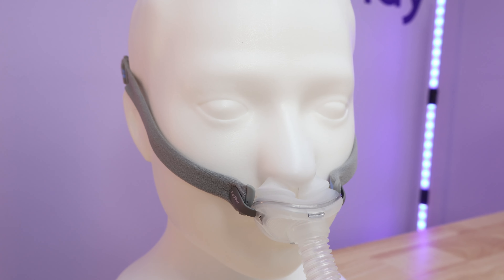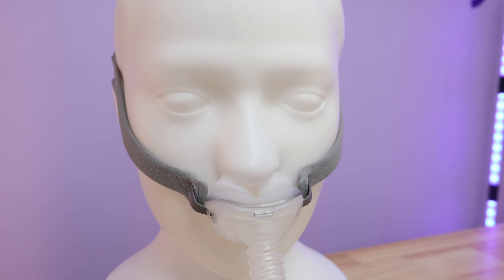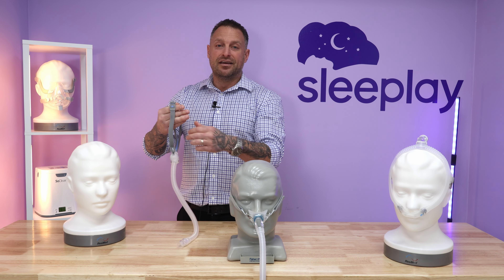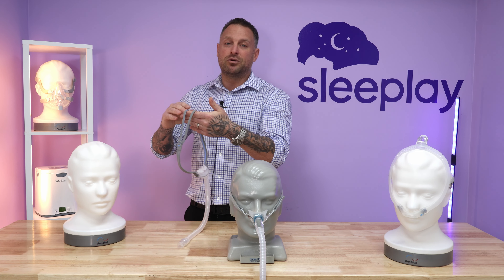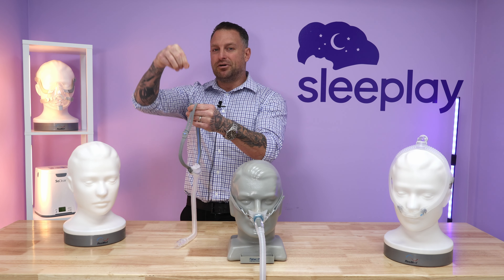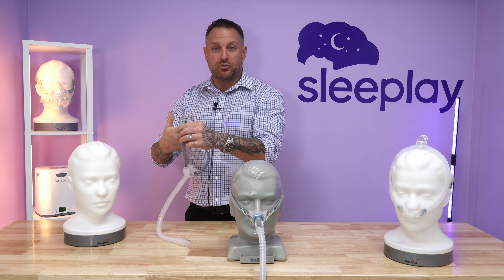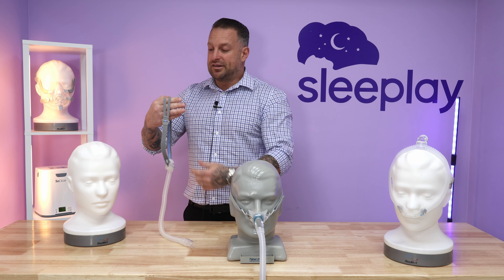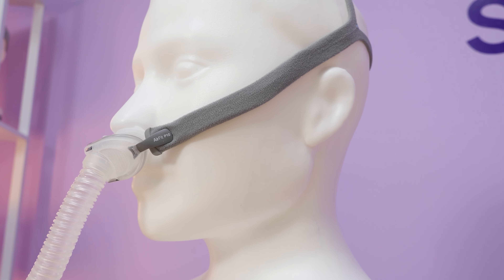It's easy to take off and put on. Some people have found if they toss and turn a little bit, it may come off the head, but it's not too often. They used to come with little clips that you would put on here as sizing tools that would pinch and pull through. They were one size fits all, and they had the little clips if you needed them smaller.